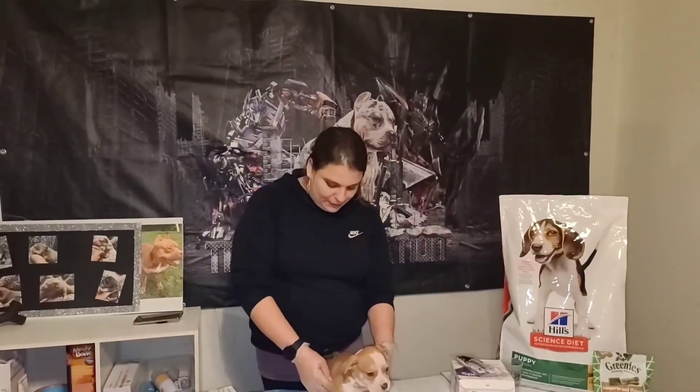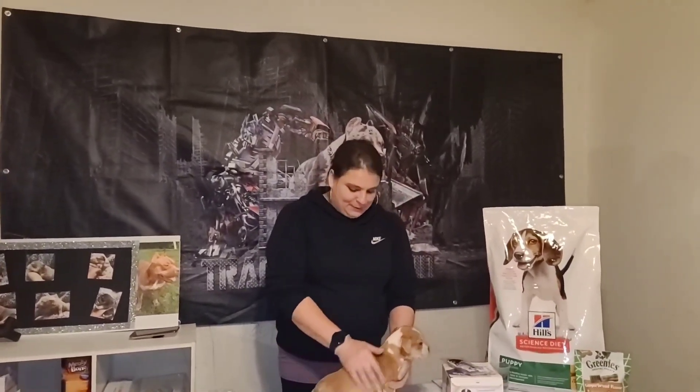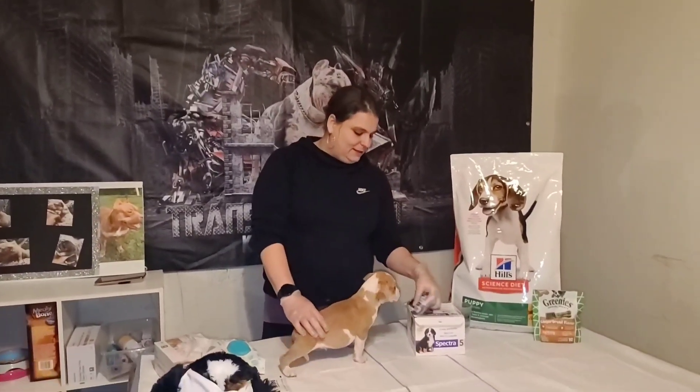Hey guys, Heather from Transformation Kennels. Today I'm going to be showing how to self-administer vaccines to your American Bully puppy. We have Deebo and Cookies and Cream pups, and they're going to be getting their six-week vaccine.